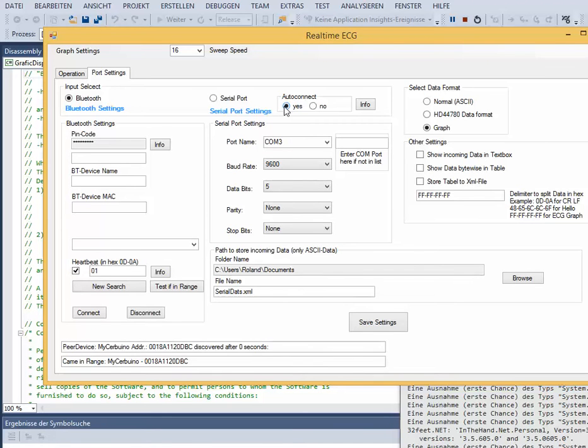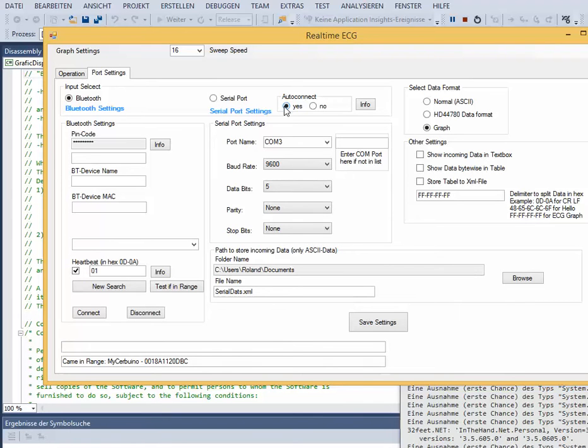Activating auto-connect means automatic connection to the device at program start. The name of the Bluetooth device MAC and password must be set to enable auto-connect.